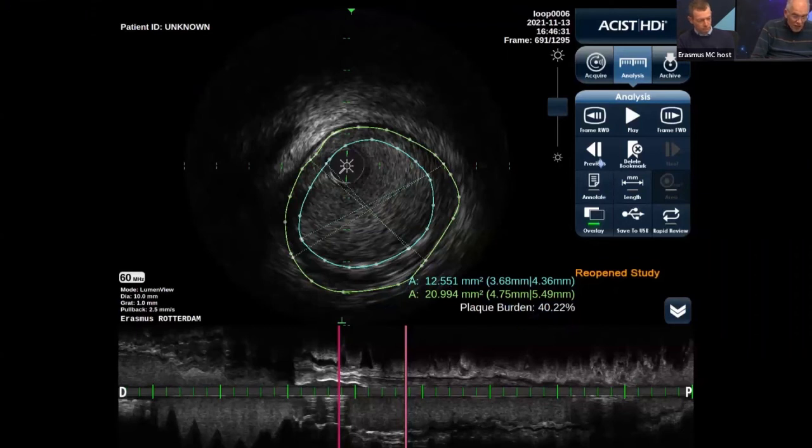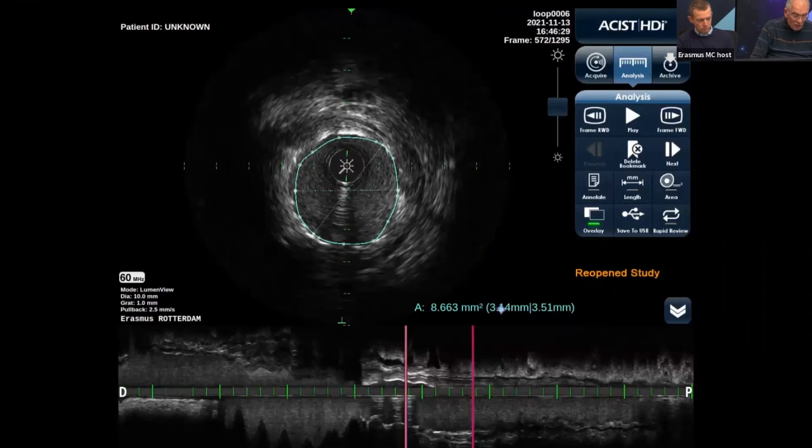And if I go back to the thing, then we have here, well, you said 5 square millimeter, well, 8.6 square millimeter. I think that looks largely sufficient. It's very likely sufficient. Okay.